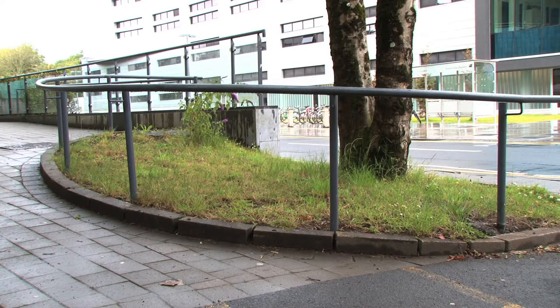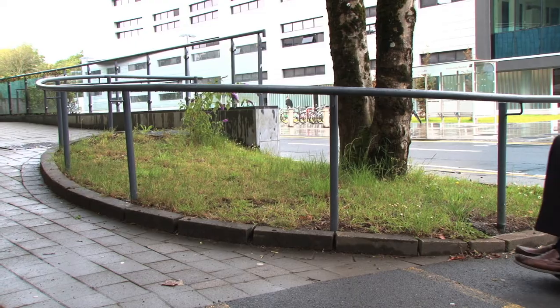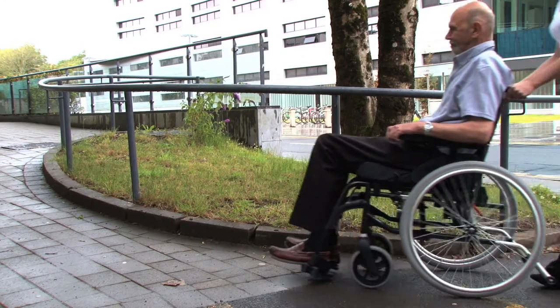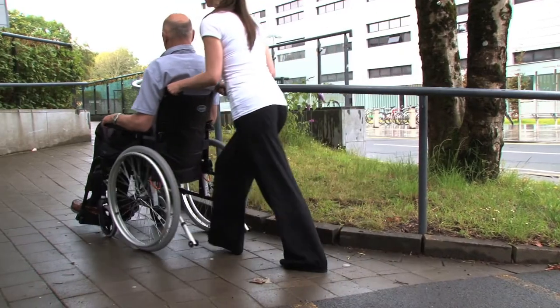When using the chair outside, the user is likely to encounter inclines and curbs. To push a chair up an incline, the caregiver bends their knees and leans towards the chair.